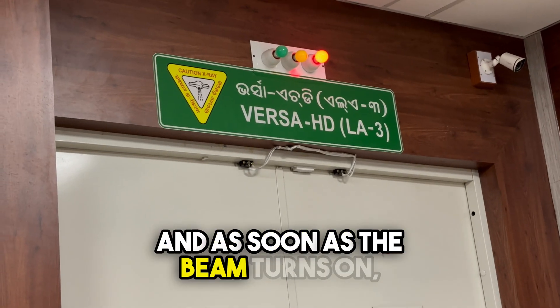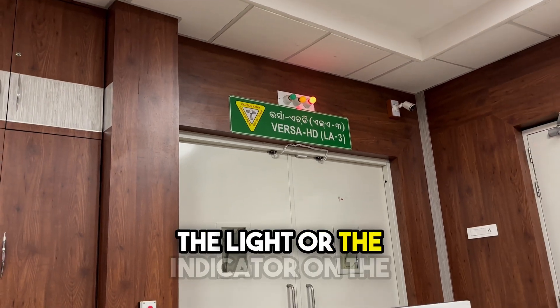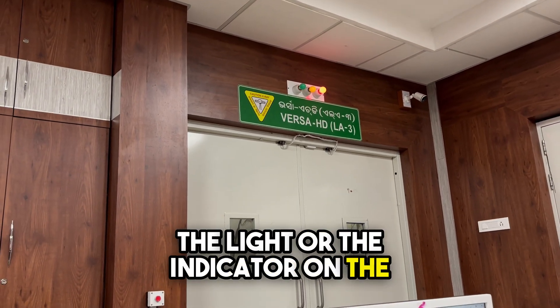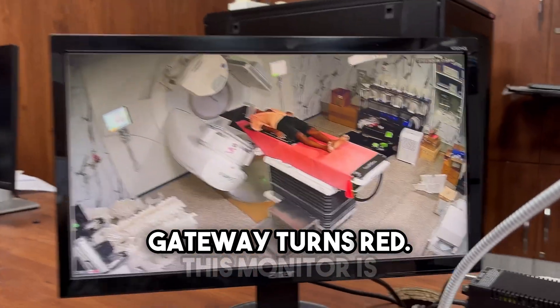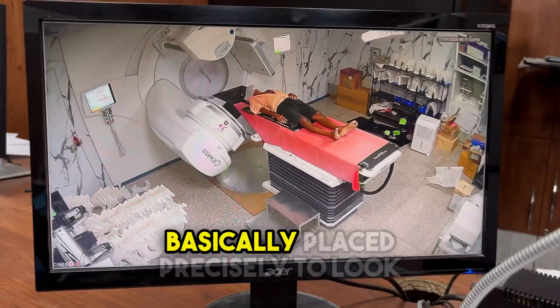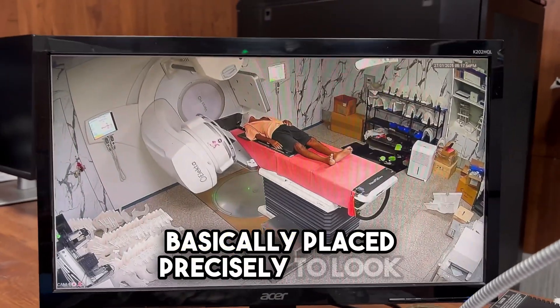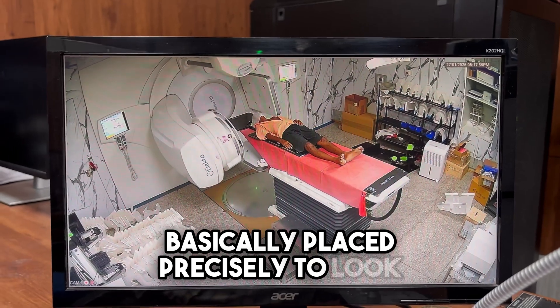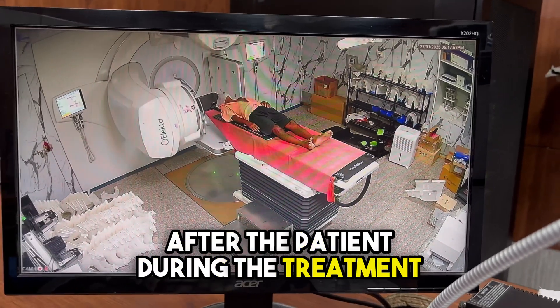As soon as the beam turns on, the light or the indicator on the gateway turns red. This monitor is basically placed precisely to look after the patient during the treatment delivery.